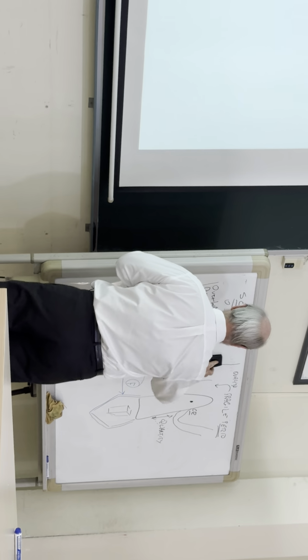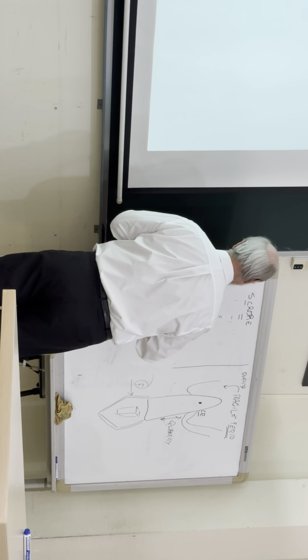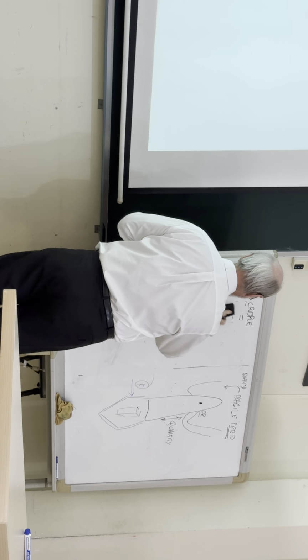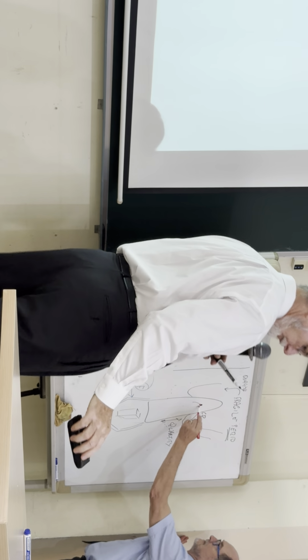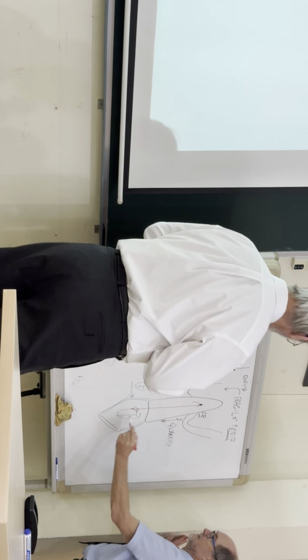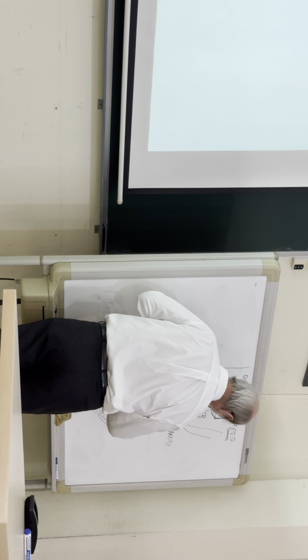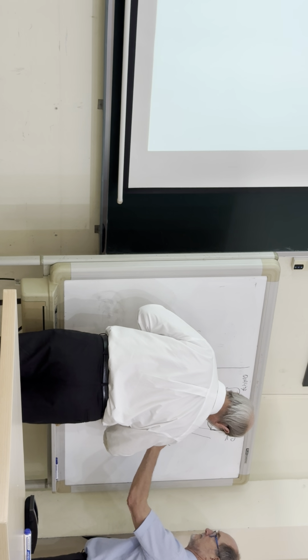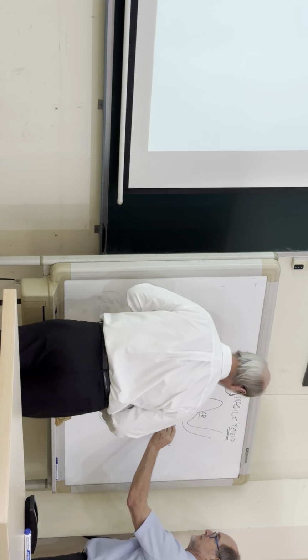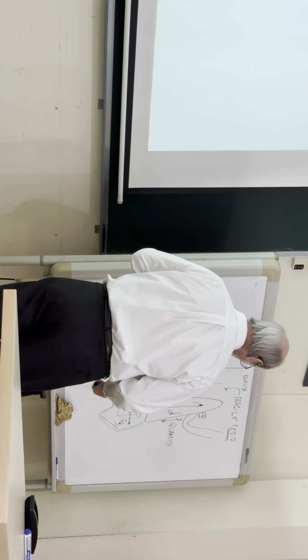What's the problem? Anybody? Okay, here we go. Yeah, that's the distance. The point of application of the force here is kind of fuzzy, but in reality there is a resultant force right here, Fr. And there's a distance. So you can see now, you have your aligner here, you have good control.